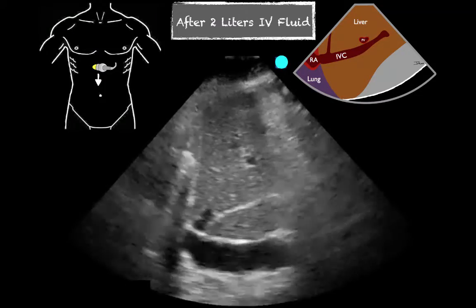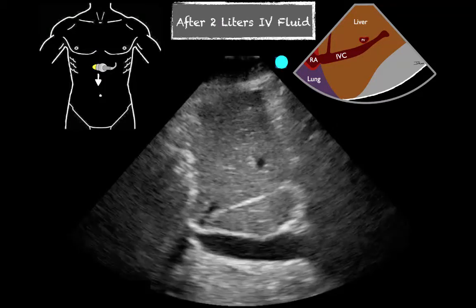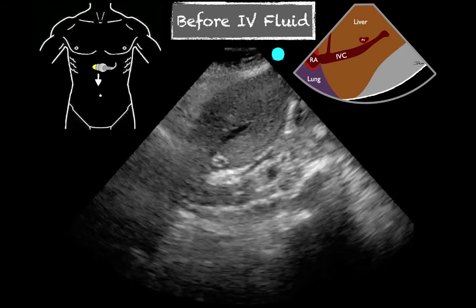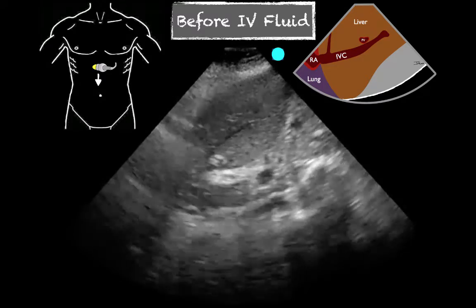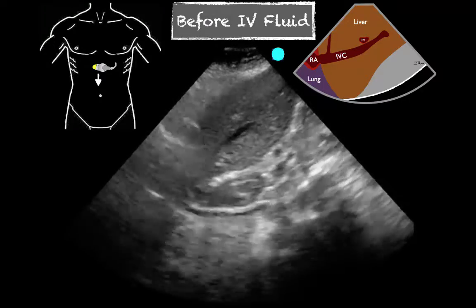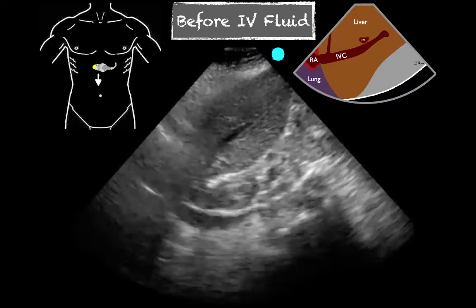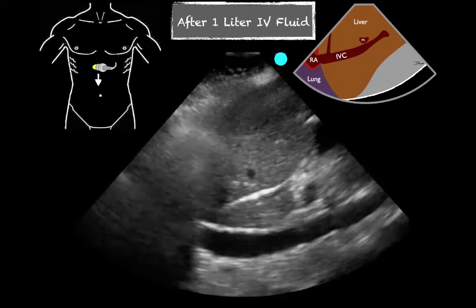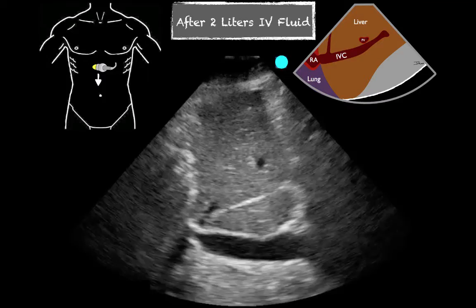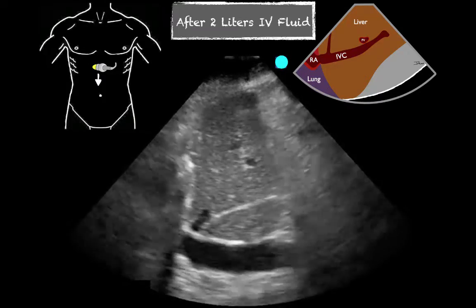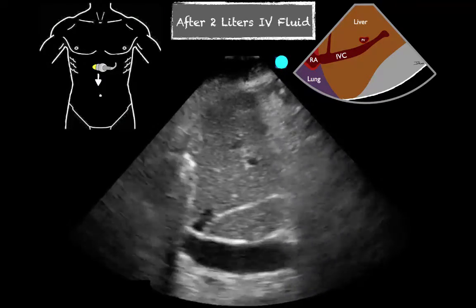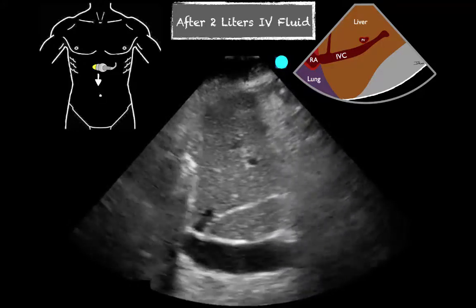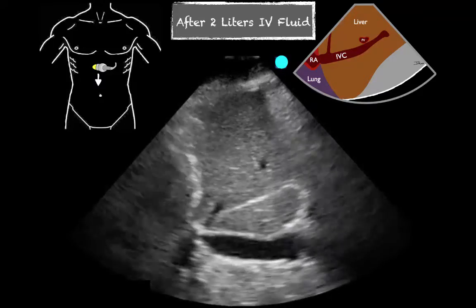Going back to the initial IVC, we can see that it's collapsible, very slit-like. Then after a liter of fluids, we see it more distended, still with variation. And then after further support, it still has variation — not quite as much, maybe only about 50% at this point. But it was clearly a little volume depleted and responded well to fluids.